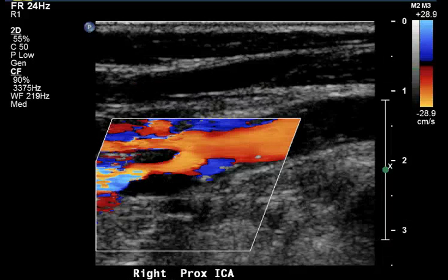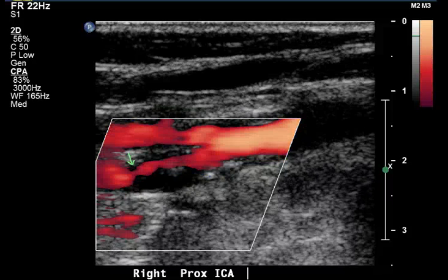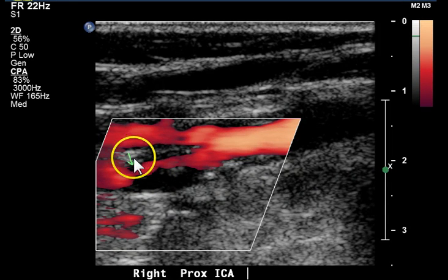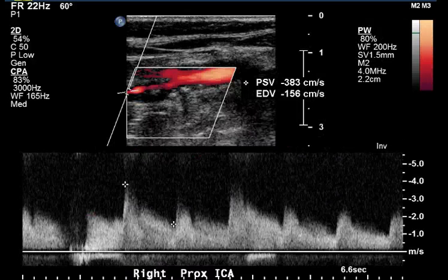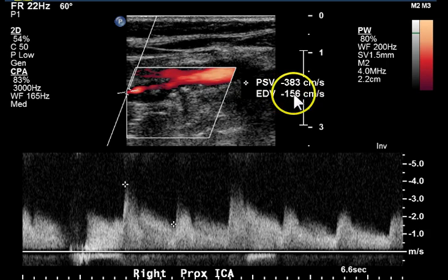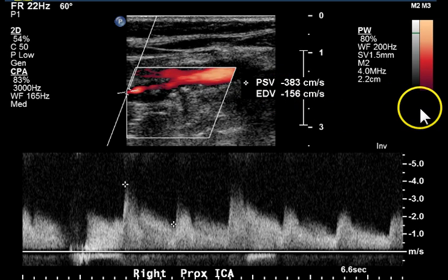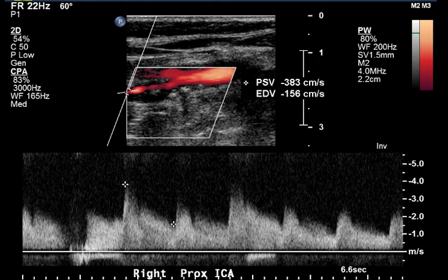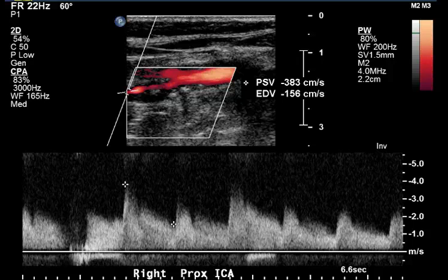Another color Doppler image and power Doppler showing the area of disease, with an arrow marking a marked narrowing of the flow lumen. Here we have a signal at that area, again with an increased systolic velocity of 383 centimeters per second and an end diastolic velocity of 156 centimeters per second.